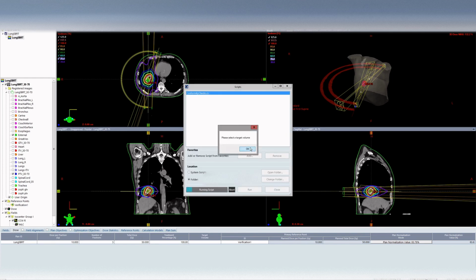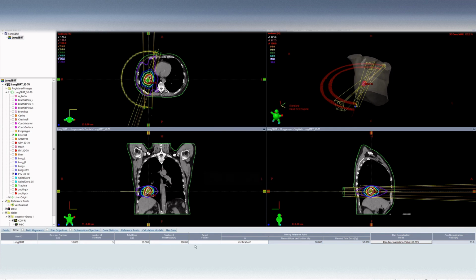Please select a target volume. So there you go. We tested that and it works. So it's always nice to let your user know what needs to be done as opposed to the script just silently, or even rudely, crashing and complaining to you.